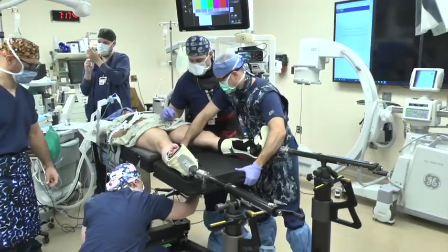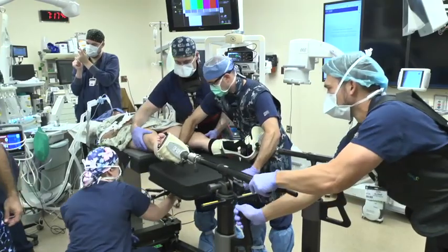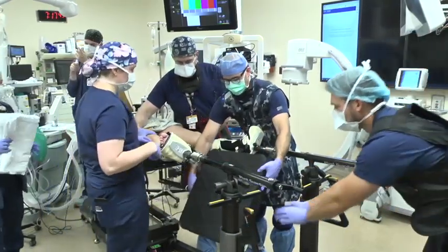The support table is removed from the bed and the boots placed within the traction arms until they click into place.